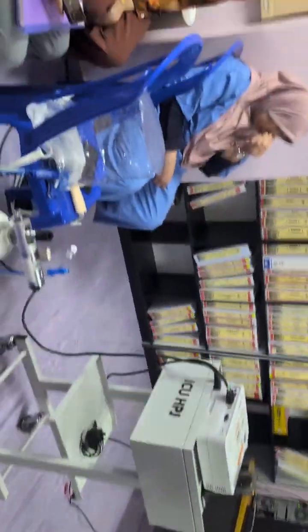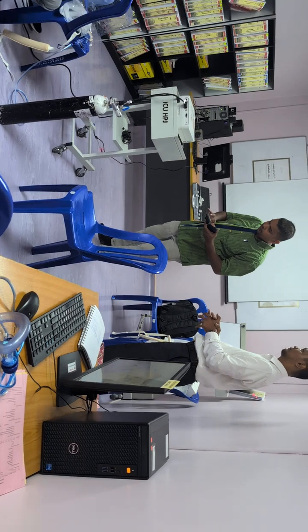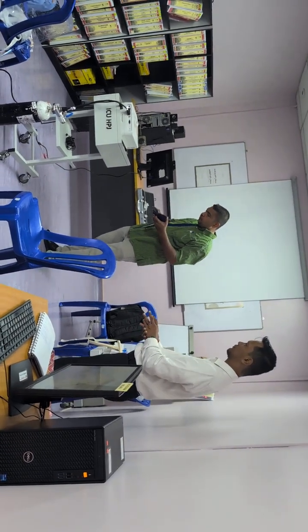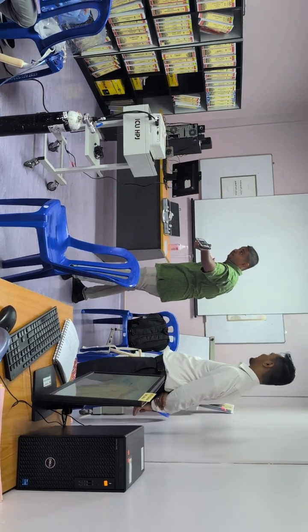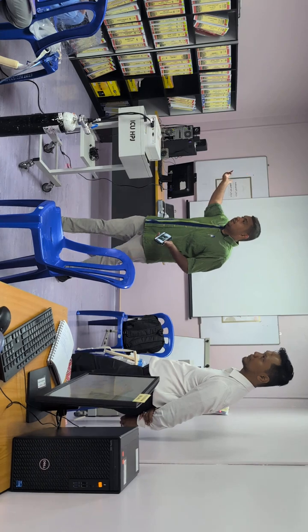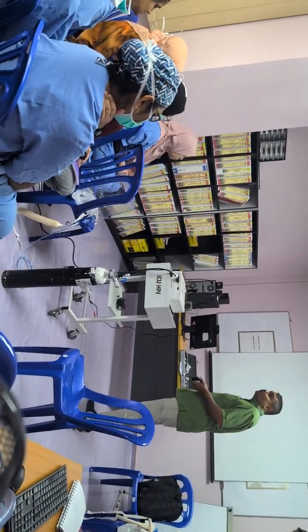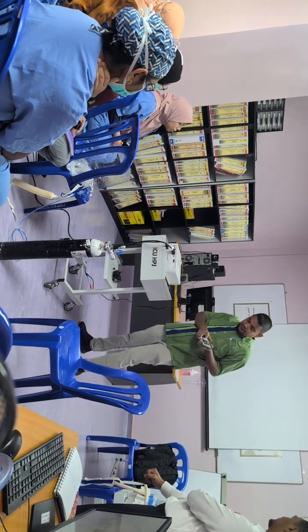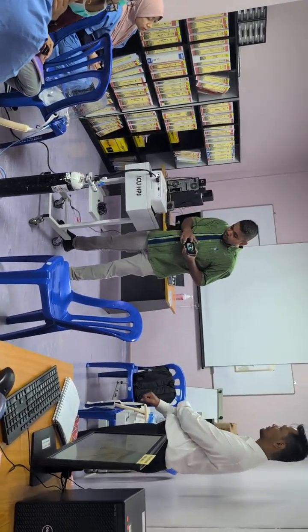I'm going to show you this video. This video was taken last week, with exactly the same delay, same everything. While I was doing it, they had a call, E9, ruptured appendicitis. Go into the emergency, and they said, okay, got another one, let's go in. So this was an Arabic patient. We went in.